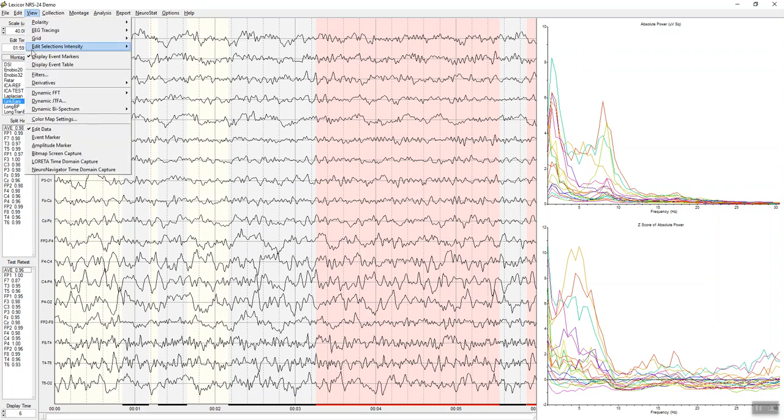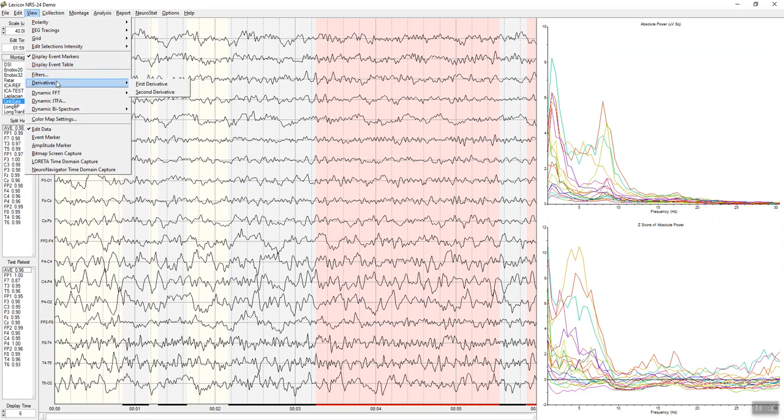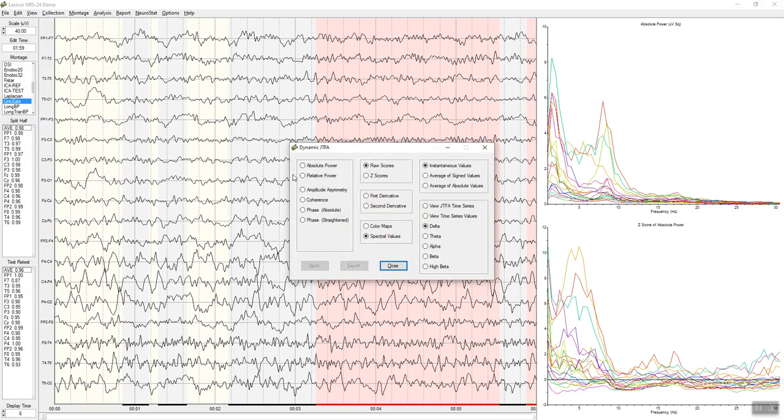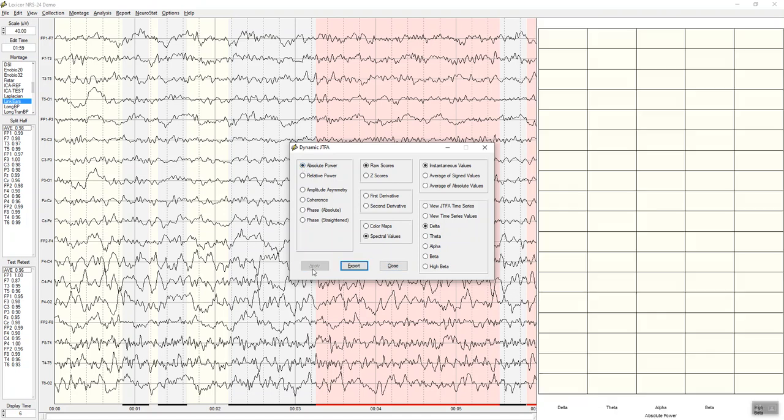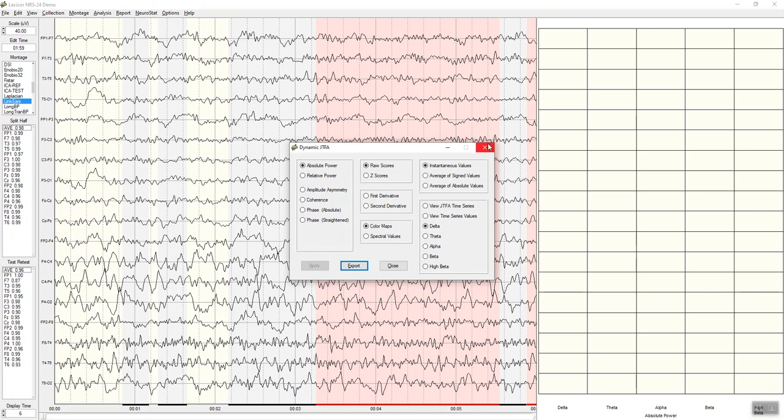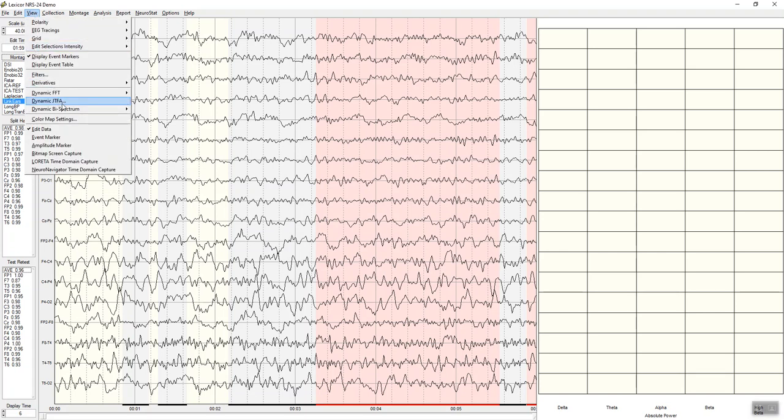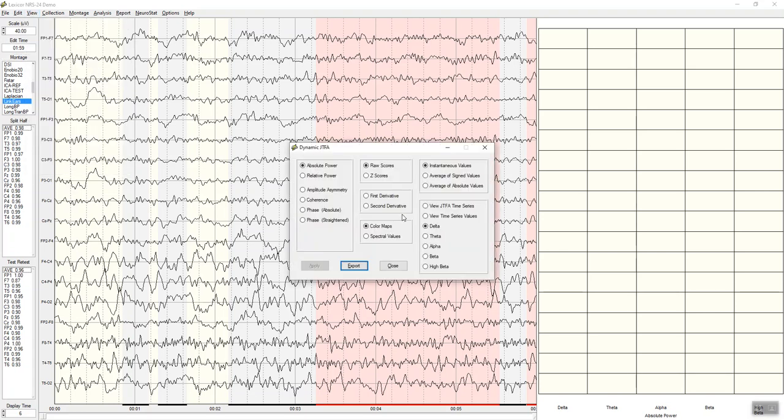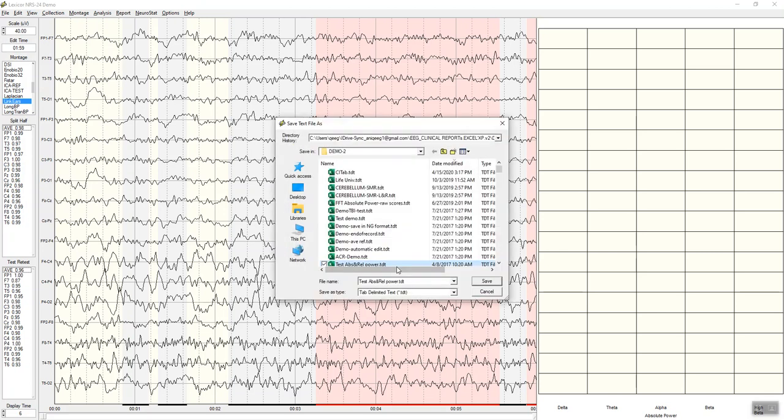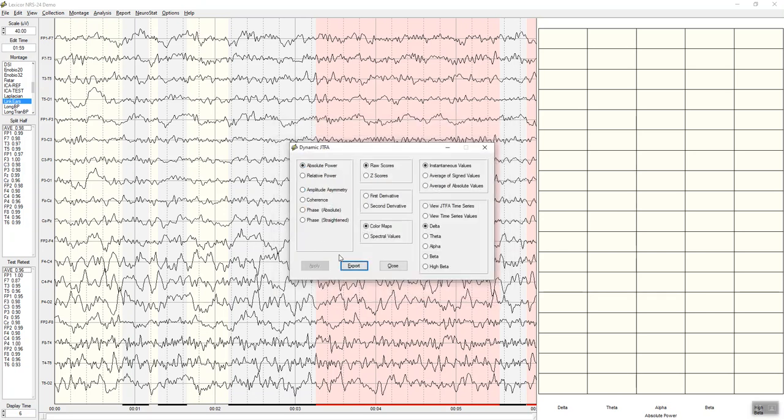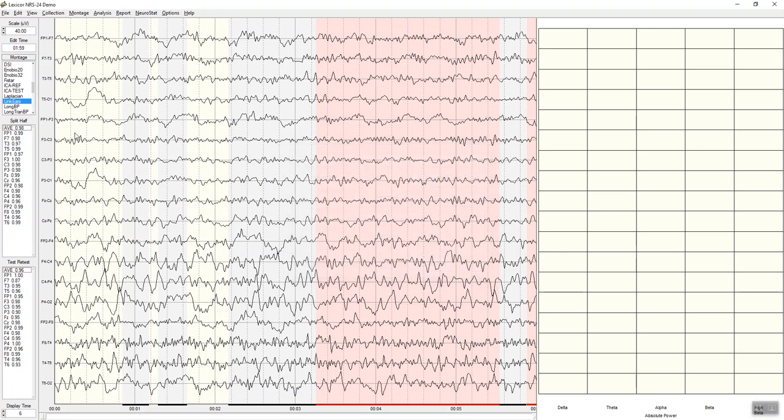Under the view menu, you can activate a display for event markers that you can manually select. We'll show in a minute filters, derivatives, the joint time frequency analysis that allows you to look at instantaneous power in color maps. This allows you to collect, close this, to evaluate different things. Here's Z-scores, for example. You can export your selections and evaluate the instantaneous moments.